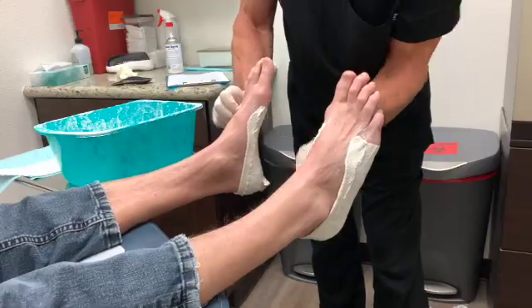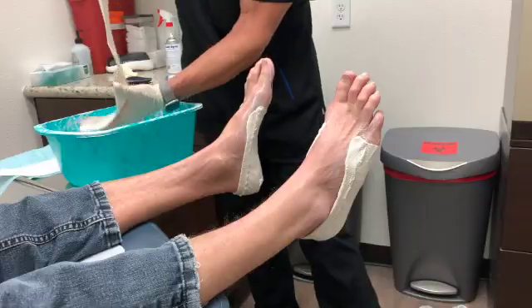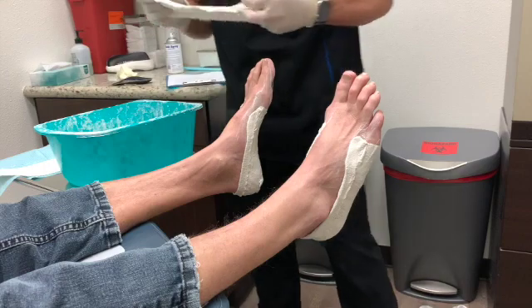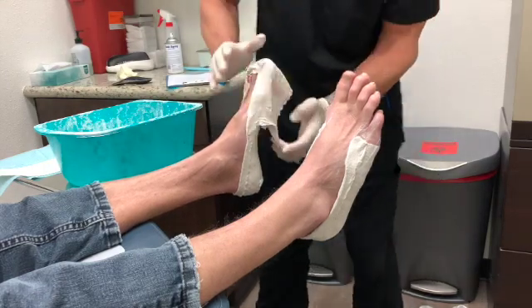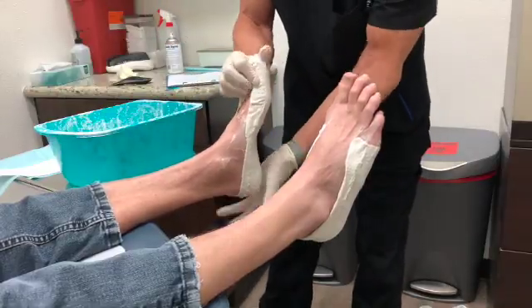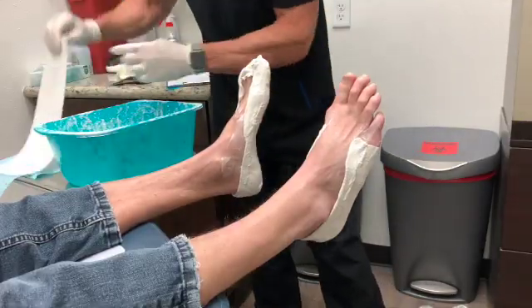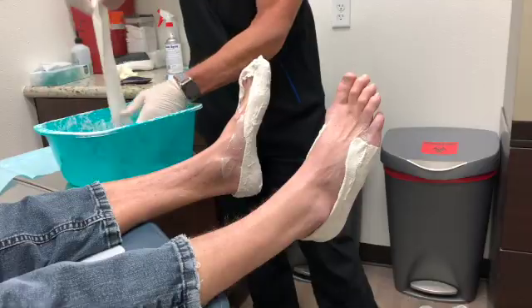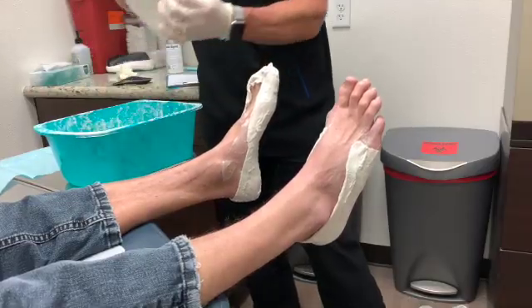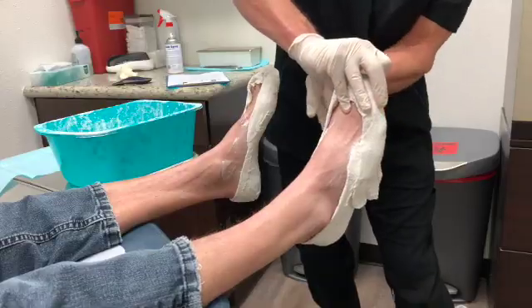When the foot is in that neutral position, the structures don't get strained, so patients won't get as many plantar fasciitis problems. We also use these for heel spurs. This young gentleman we're doing for metatarsal pain on the top of the foot and a tendon called the posterior tibial tendon on the inside. When he's held in the neutral position, the foot basically locks. Now that I have the plaster on, he's ready to be molded for the device.